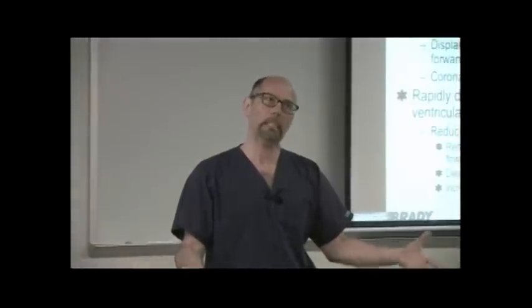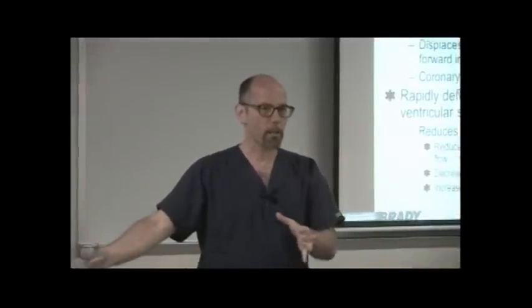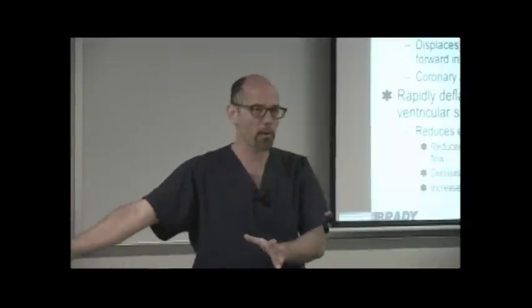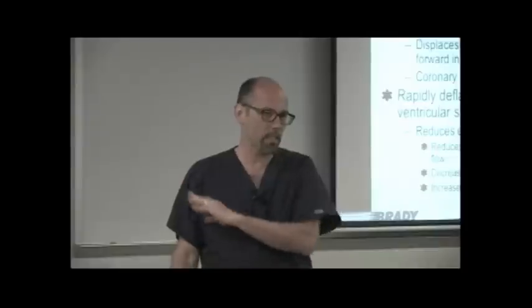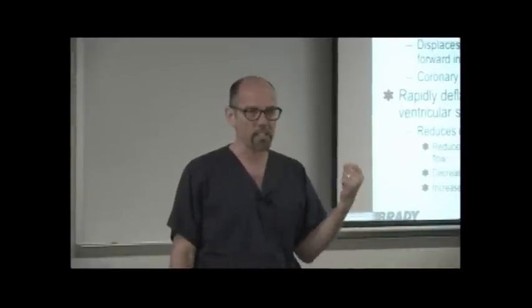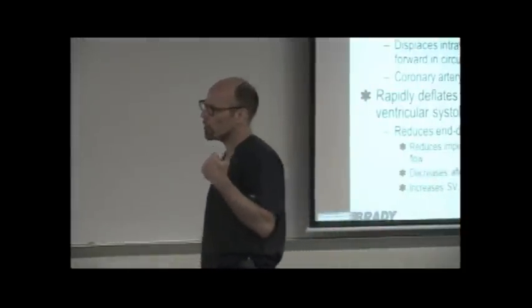Can I guarantee that every hospital you go to around the state is going to have the most state-of-the-art balloon pumping equipment? Probably not. The most common kind of device is made by Maquet, and most everybody around here has that device. There are other devices that work a little bit differently, and I can't speak to exactly how they work, but around here it's going to be a Maquet balloon pump with a very sophisticated operating mode, because that technology's been around for like 10 years, so I can't imagine anyone's working with a balloon pump that's older than 10 years right now, because they don't work well that long. Okay, so you would be okay around here.